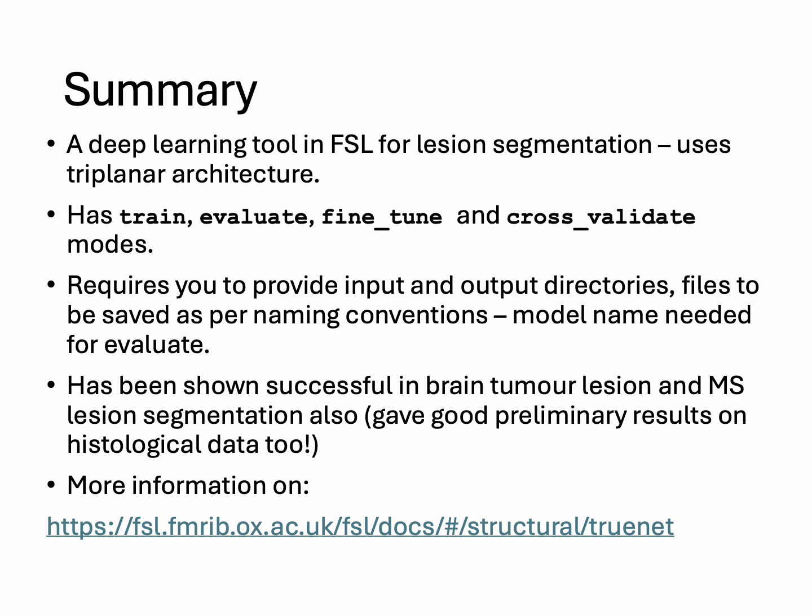Okay, so let's go through a quick summary of the things that are discussed here. The first one is that we are introducing a deep learning tool, FSL TrUE-Net, for lesion segmentation. It uses the triplanar architecture and uses U-Net as a building block, and hence the name triplanar U-Net ensemble network.